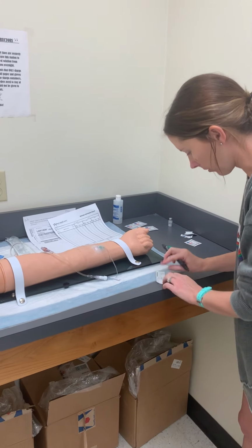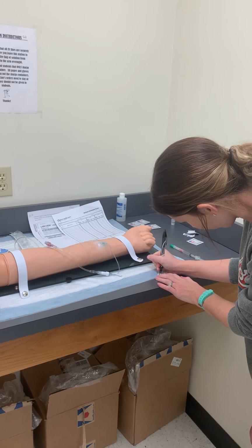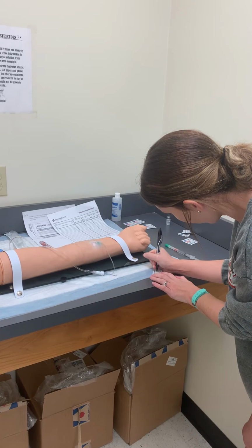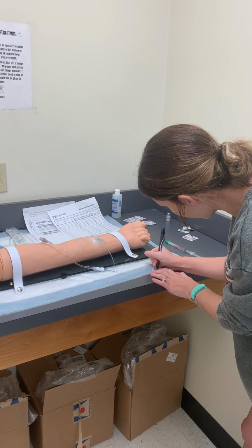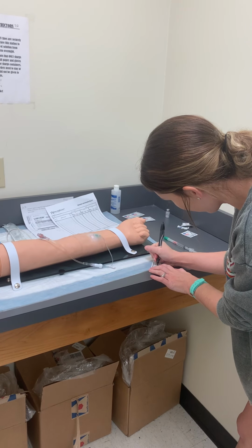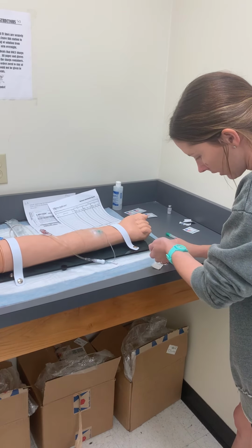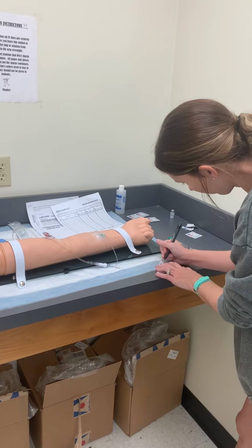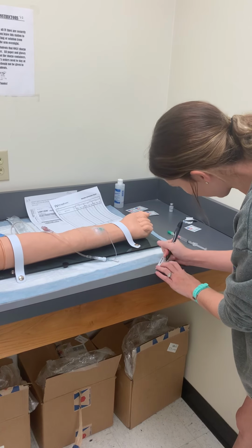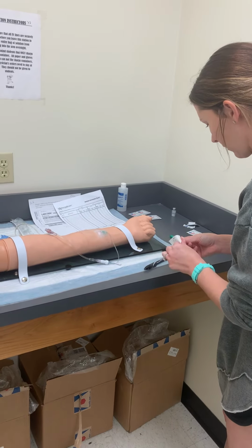Right, the next thing I want to do is label my syringe, because we are in the nurse's station. So on my label, I want to put my patient's initials. I want to put the drug, so I'm going to put Lanoxin. And the amount is 0.2 milligrams. Prepared date, 10/21. The time, which is 1 o'clock, 1300. Prepared by, and my initials. And I want to put this label on my syringe.